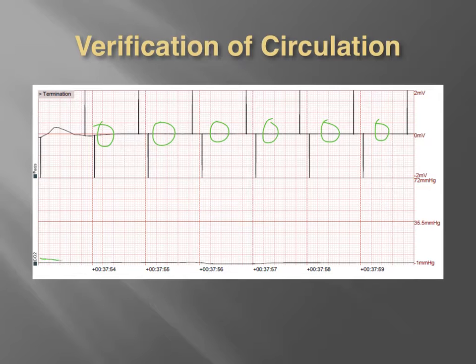And you can see there might be a very low blip right here of the last final ventilation, where there was probably, over the course of time, residual carbon dioxide in that dead space that had to be blown off and cycled out with ventilation, even though we had these pacer spikes and no capture at all. Another good example of where we might actually have a waveform for a very short amount of time, if there's any residual carbon dioxide that is able to be blown off from the lungs despite lack of pulses.